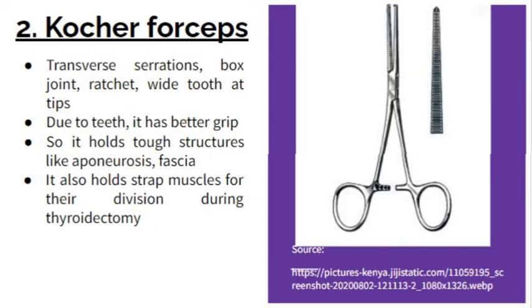The second forcep is the Kocher forcep. It also has transverse serrations on its jaw, a box joint, and a ratchet. What makes it different is that it has a wide tooth at its tips. This tooth is not pointed — it is a polygonal, wide tooth.